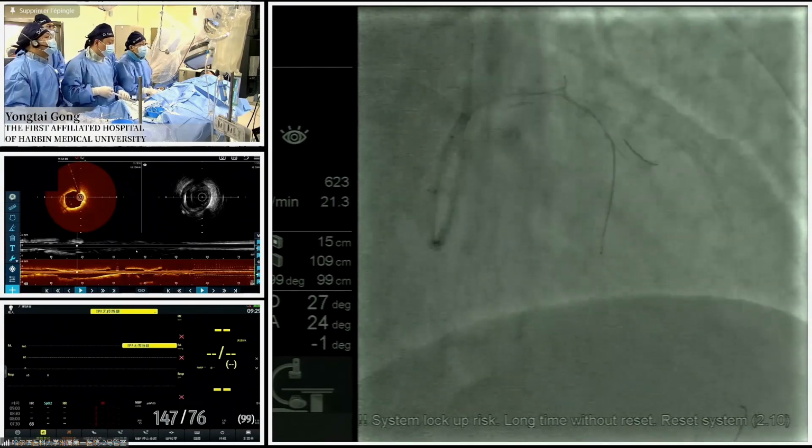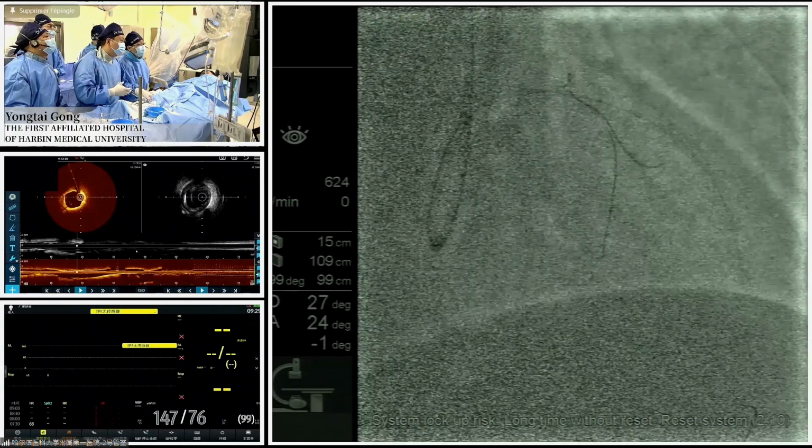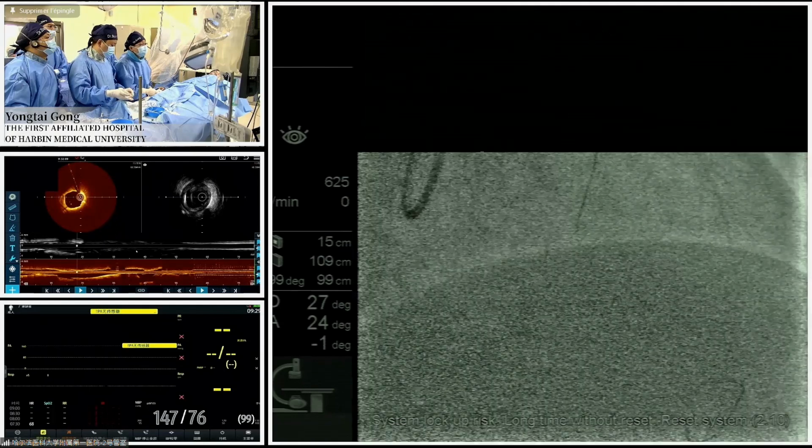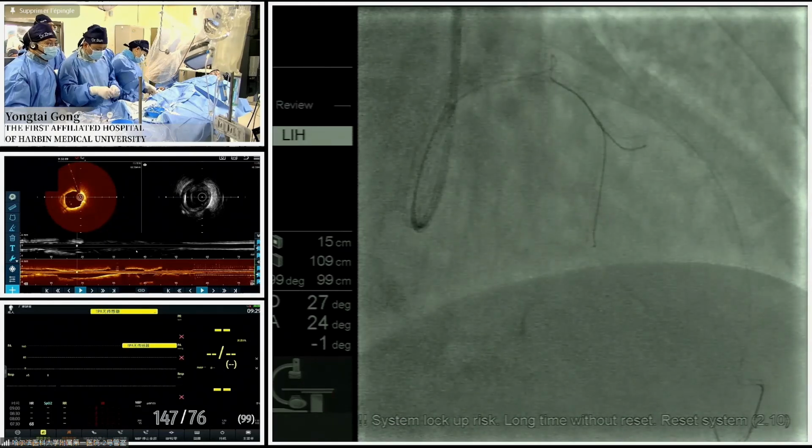Give me a little contrast. Correct. Check the flow. Okay. Very excellent. Dr. Gong, what are you up to?